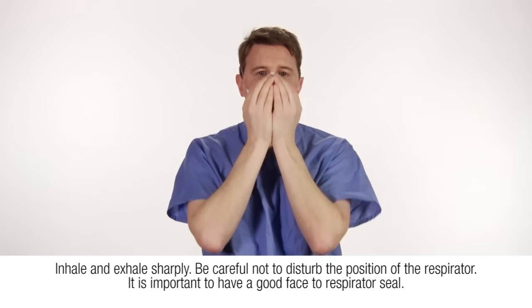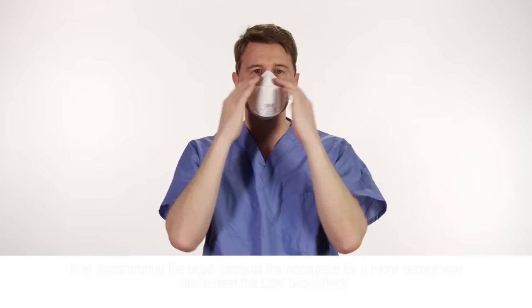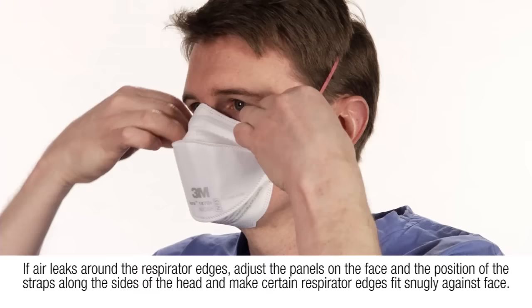Inhale and exhale sharply. Be careful not to disturb the position of the respirator. It is important to have a good face-to-respirator seal. If air leaks around the nose, readjust the nose piece for a more secure seal and repeat the user seal check.